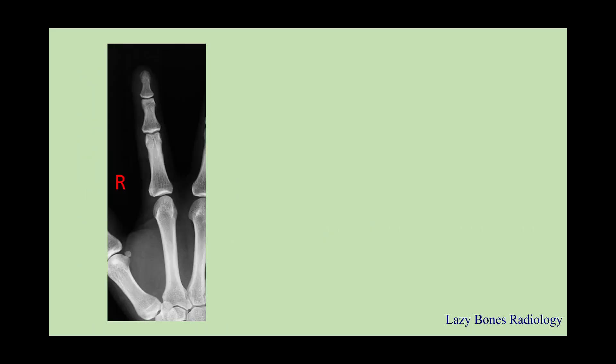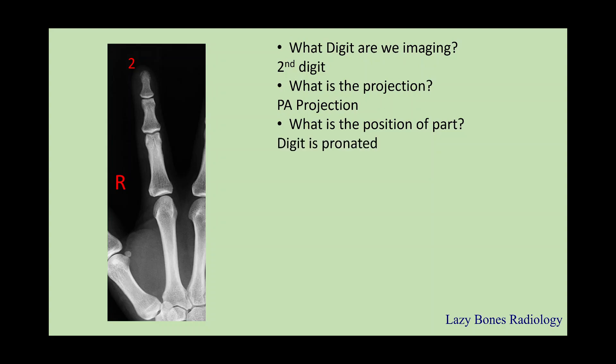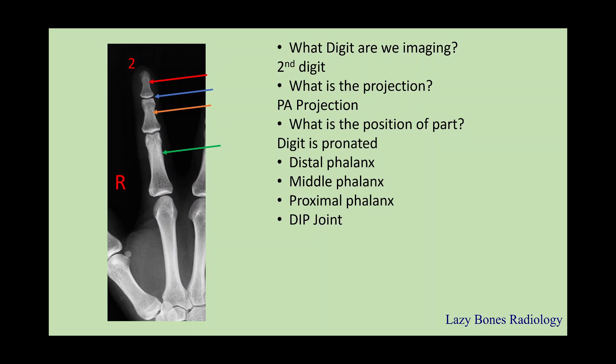Let's practice. This is an x-ray of the second digit. What are we imaging? The second digit. What is the projection? This is a PA projection. What is the position of the part? The digit is pronated. Now let's practice some anatomy: this is the distal phalanx, middle phalanx, proximal phalanx. In between the distal and middle phalanx is the DIP joint, also known as the distal interphalangeal joint. Next, the PIP joint. Next is the second metacarpal, and in between is the metacarpal phalangeal joint.